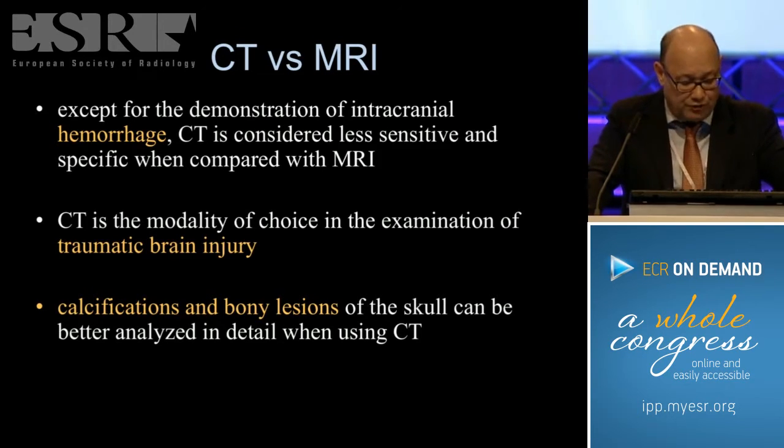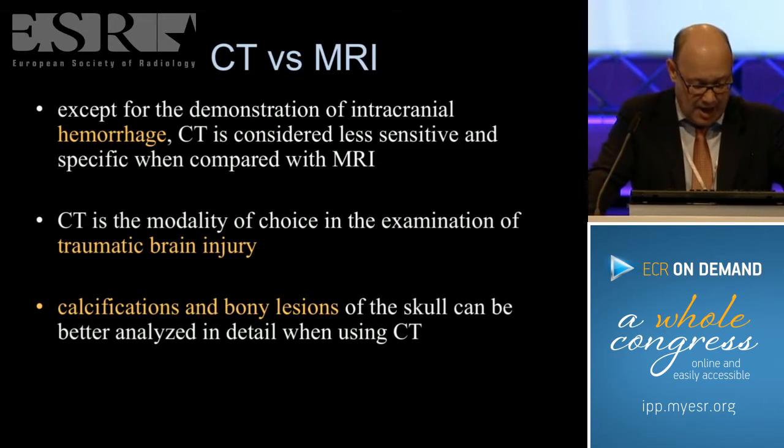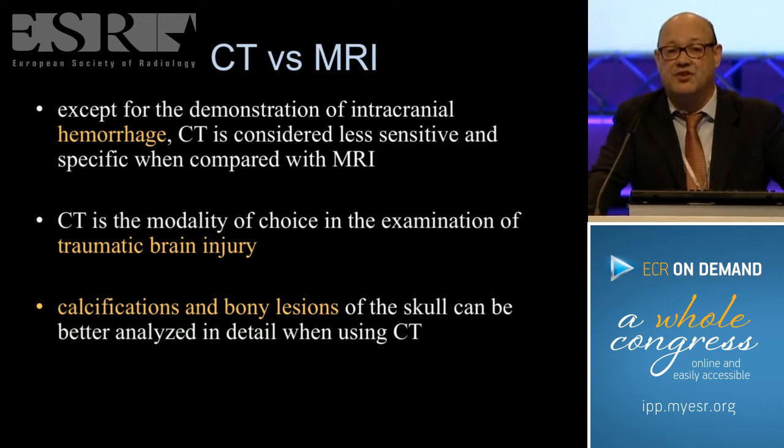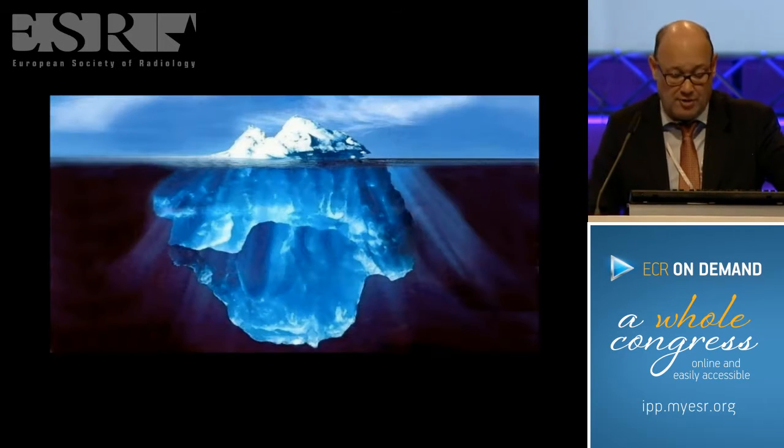But I think you all will agree, if you want to rule out hemorrhage, if you deal with patients that suffered from a traumatic brain injury, or when you want to look for calcification, or you want to look into detail at bony lesions, most of you would go for CT and not for MR.